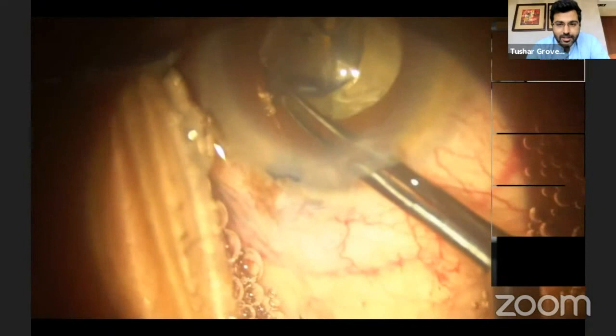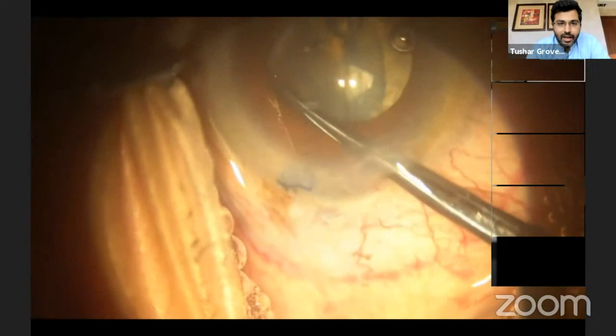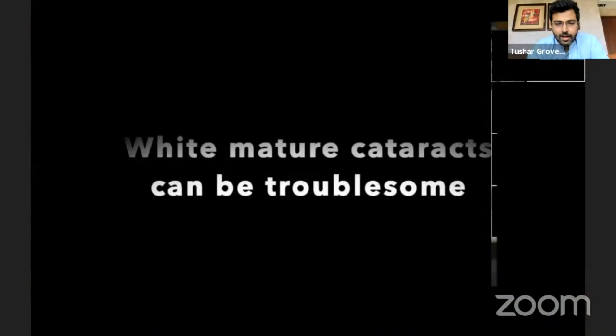In these situations this can be quite tricky because you have that uncut area, and it's possible that this can go peripherally. So it's important to be extremely gentle and extremely careful and do a manual capsulorhexis in this area. With regular capsulorhexis forceps, doing it very slowly and gently, we were able to satisfactorily complete the manual capsulorhexis, take the capsule out, and this particular case was uneventful after that.